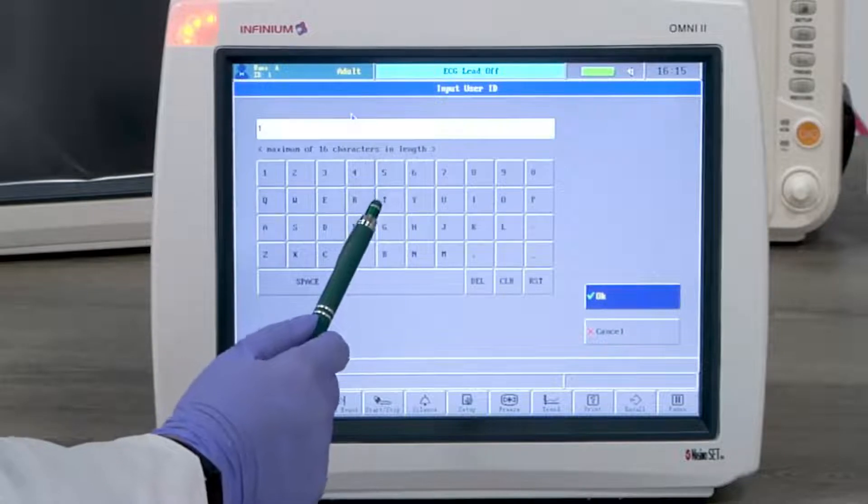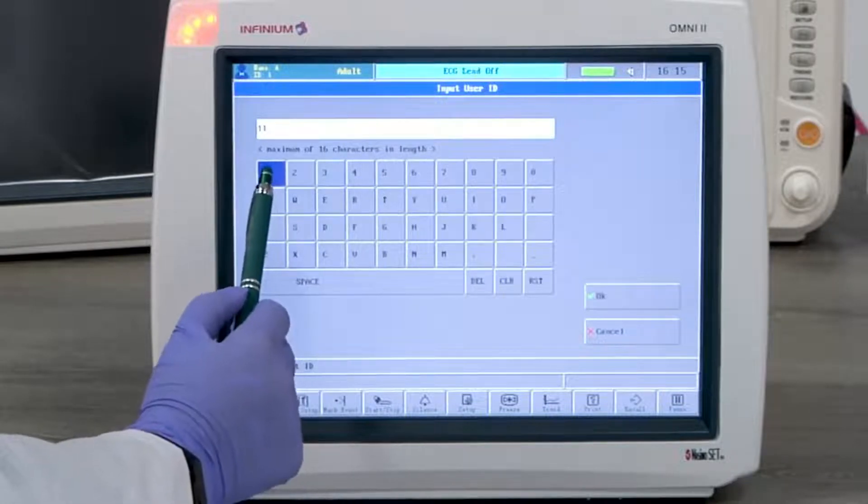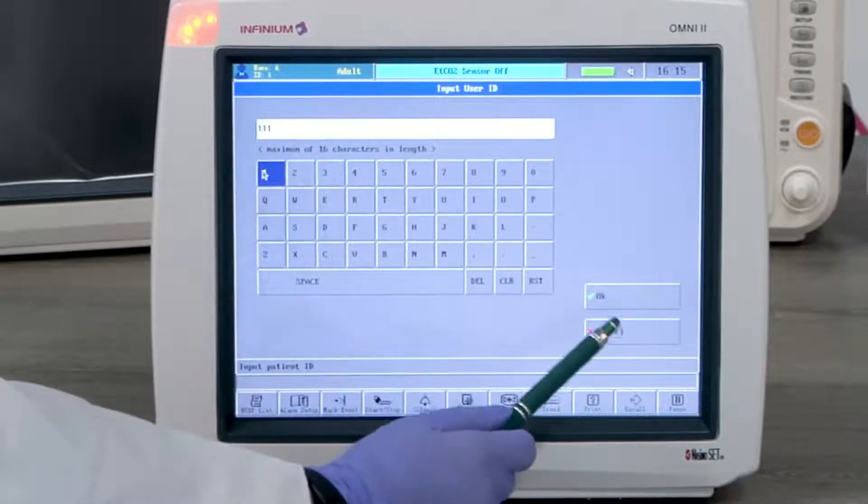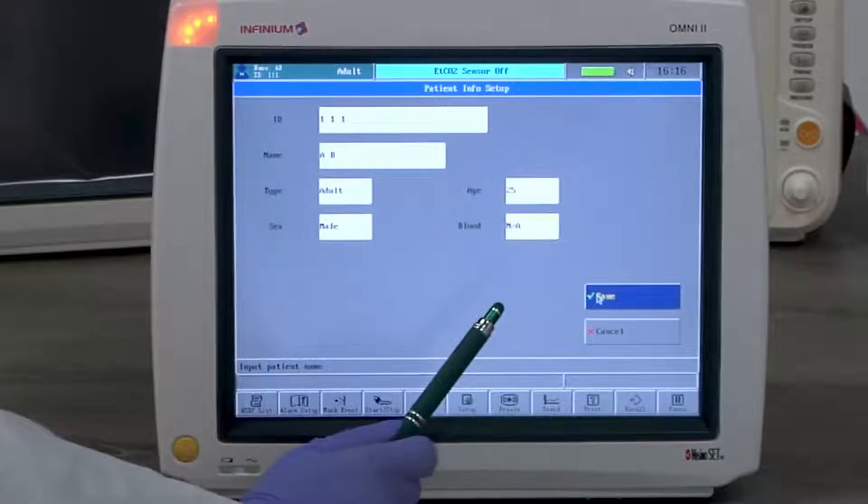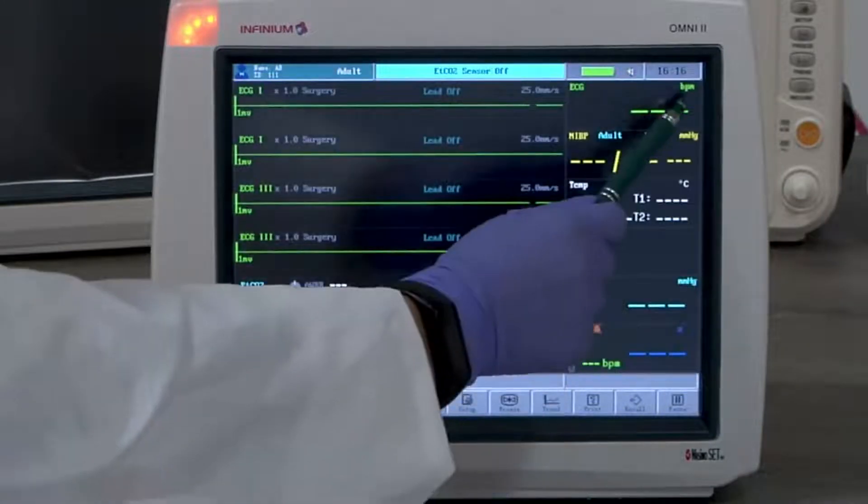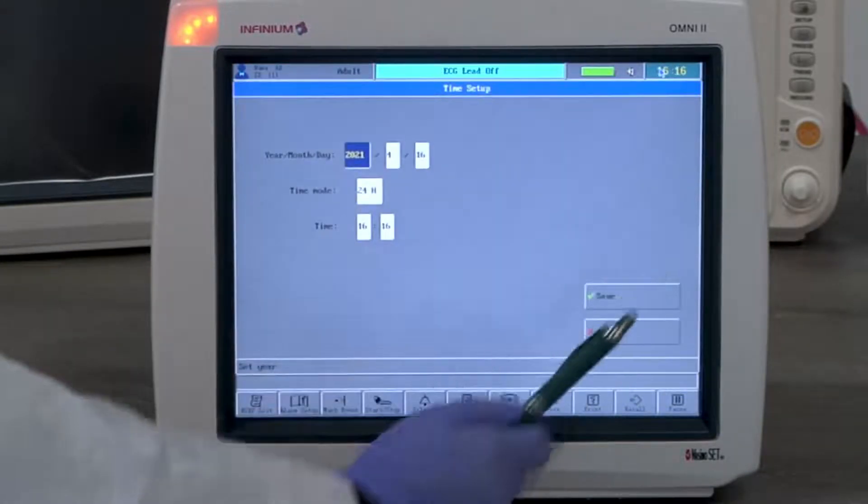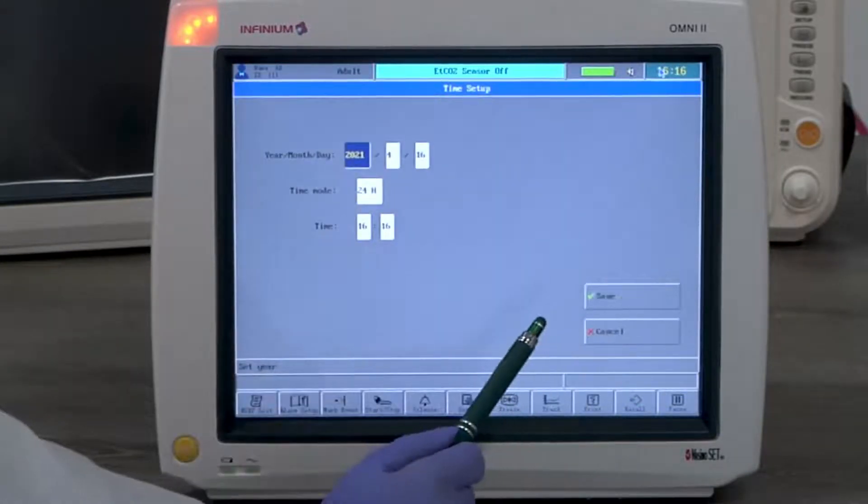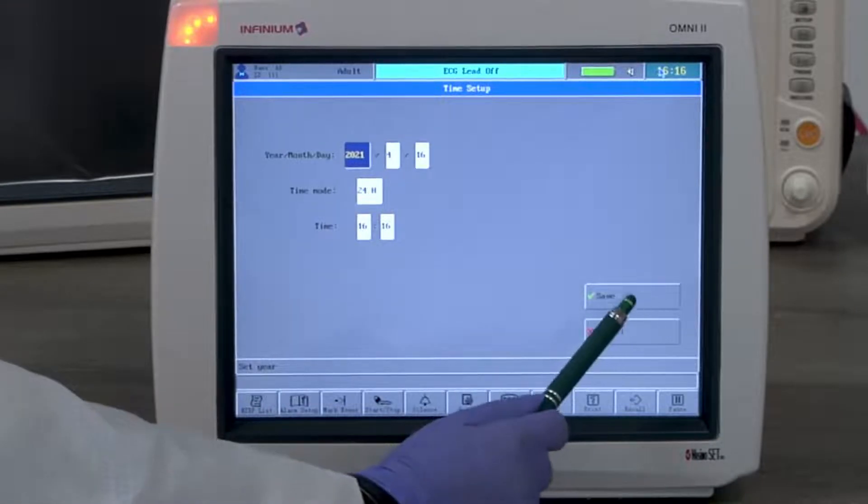Here you can set up the patient info accordingly. For time and date, by tapping on the top right corner, you will enter the time setup menu. Here you can set up the time and date accordingly.